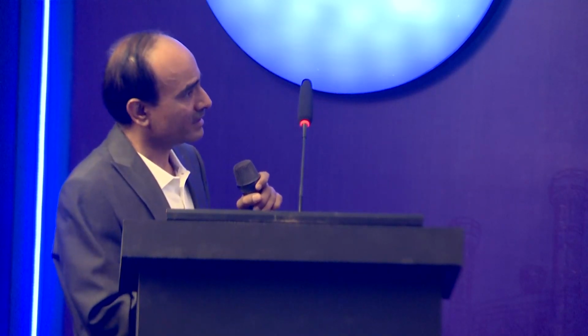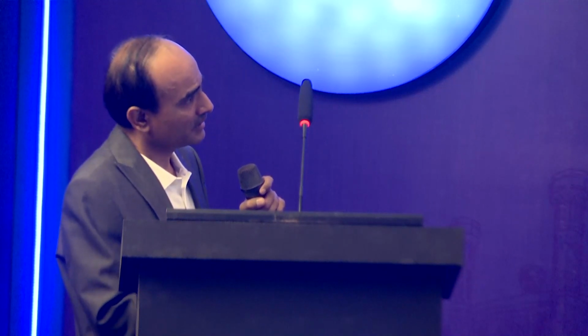In this slide, we wanted to put in another wire, but unluckily we could not. The next thing was snaring, but because the wire was not going luminal and was sticking in the ostial struts, if we take the snare in, it can also get the stent struts entangled within it. That was a bad thing. After frustration, the next thing we tried was a 1.0 balloon on the same wire.